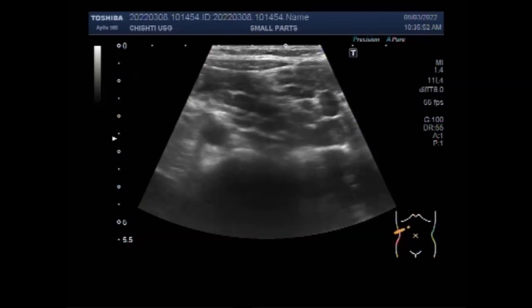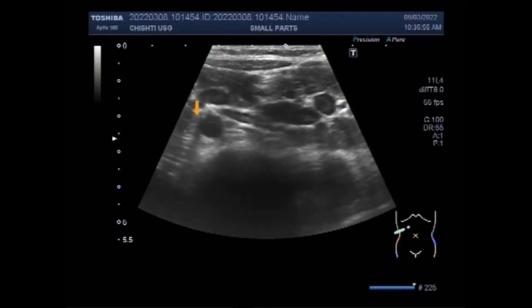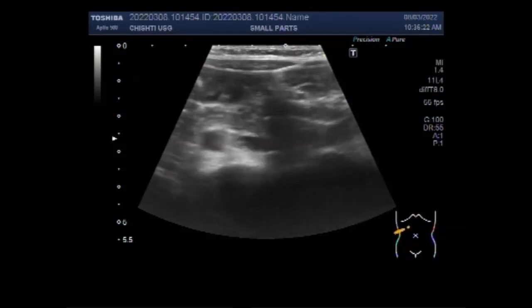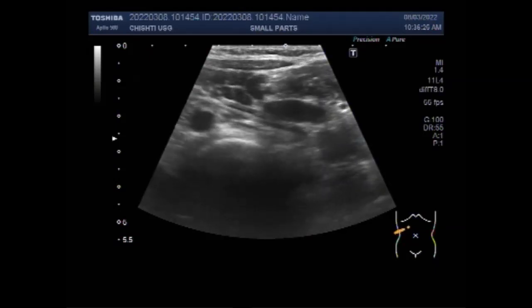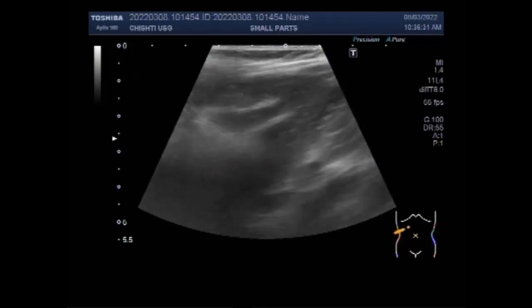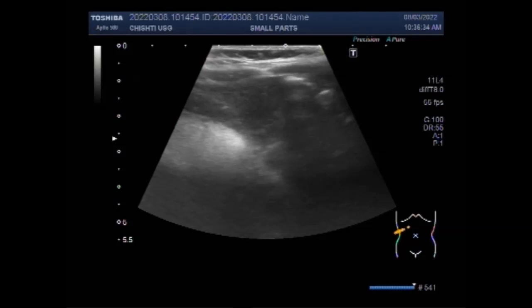Now again, you can see the enlarged lymph nodes. Lymph nodes are generally considered to be normal if they are up to one centimeter in diameter. However, some authors suggest that epitrochlear lymph nodes larger than 0.5 centimeter, or inguinal lymph nodes larger than 1.5 centimeter, should be considered abnormal. Little information exists to suggest that a specific diagnosis can be made on node size alone.